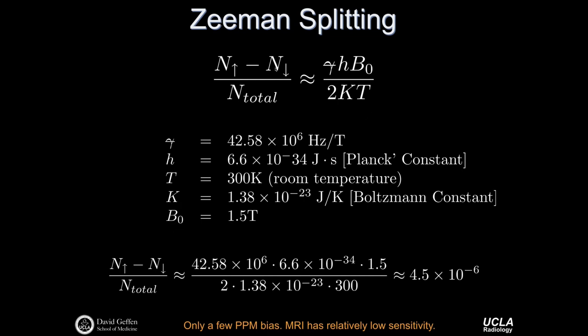And this expression, the Zeeman splitting expression, is what primarily drives, or at least in principle drives, an interest in higher and higher magnetic fields for MR imaging. And so while 1.5T was the earliest clinical standard, and that moved to 3T for lots of applications around 2000 or slightly before, now people are increasingly investigating 7T systems, 9.4T systems, and even higher whole body systems for human subjects imaging. We'll talk about the complexities associated with very high field imaging in later lectures, but this is one motivation for considering higher field strengths.